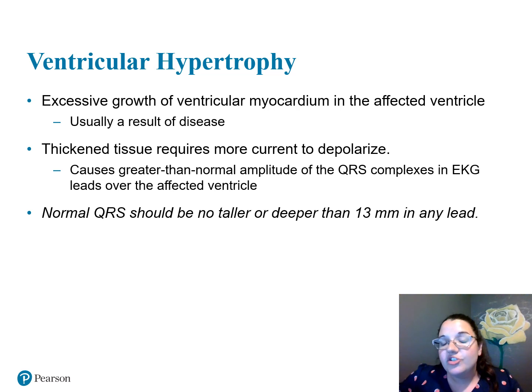Do I have ventricular hypertrophy? This is excessive growth of your myocardium. Remember your layers of your heart? Endo, myo, epi, right? Outside, epi; middle, myo; inside, endo. Do I have excessive growth of my middle heart tissue in the affected ventricle?